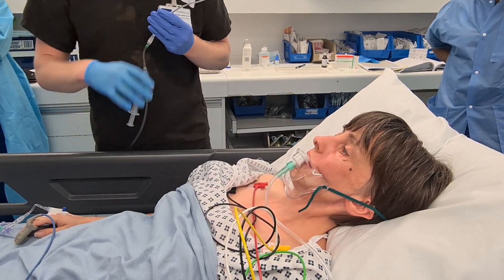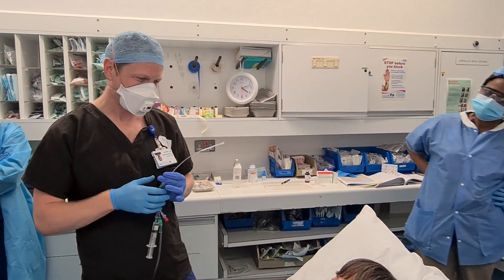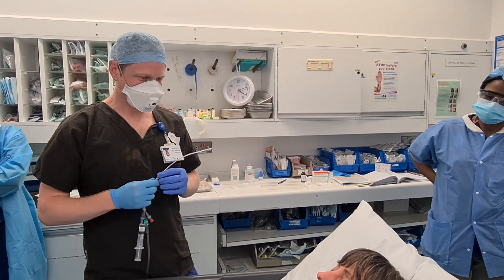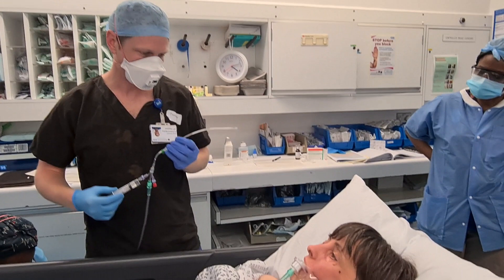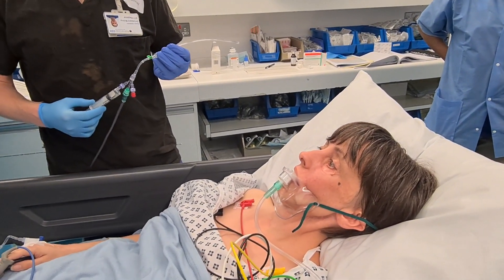Okay, I'm going to give you a break. So my hope is that's going to start being a bit numb at the back of the throat. You may notice being a little bit guttural with your speech. If I ask you — just count to ten for me. One, two, three, four, five, six, seven, eight, nine, ten.